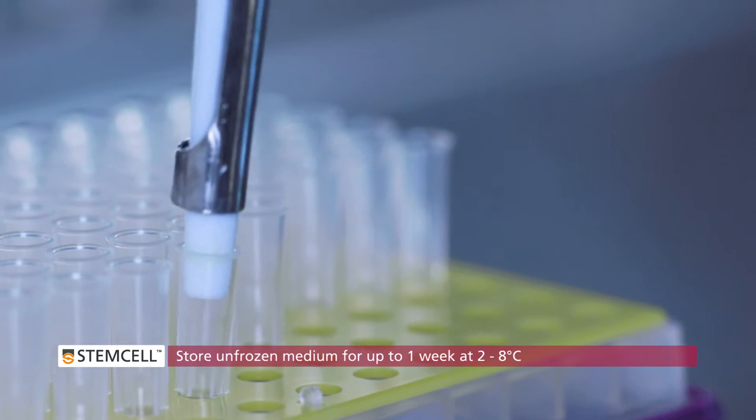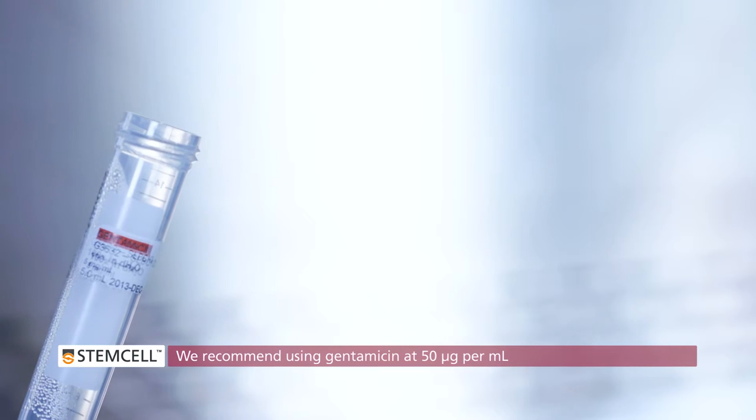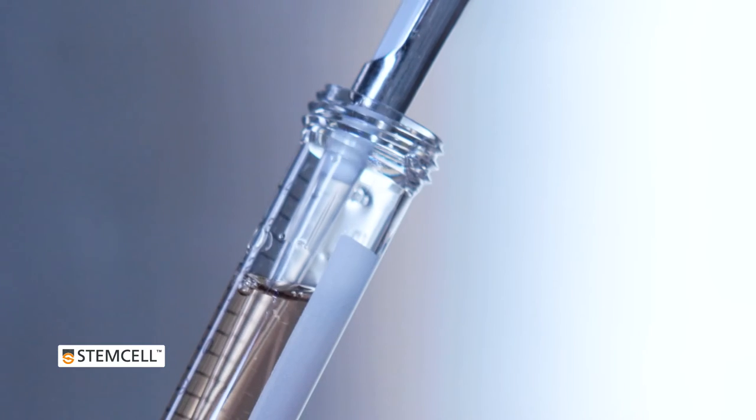Intesticult Organoid Growth Medium does not contain any antibiotics. You will need to add your desired antibiotics before using the medium in your experiment. We recommend using Gentamicin at 50 micrograms per milliliter.